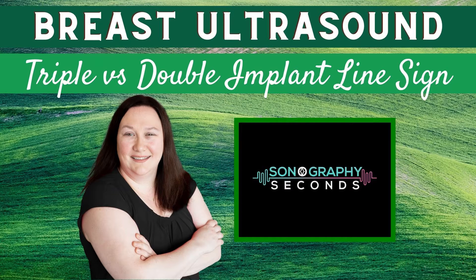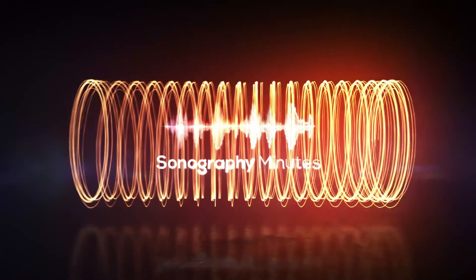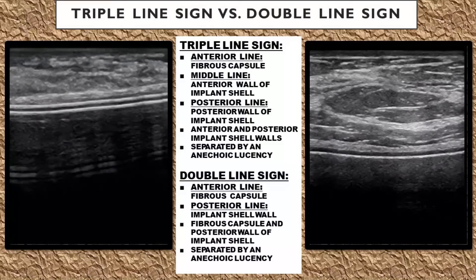On today's edition, let's talk about the triple line sign versus the double line sign of breast implants on ultrasound.